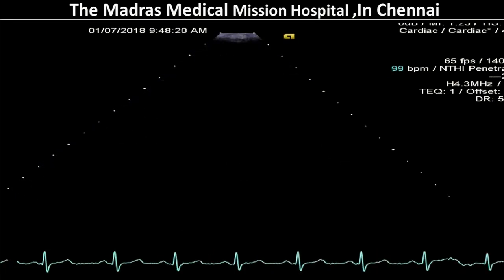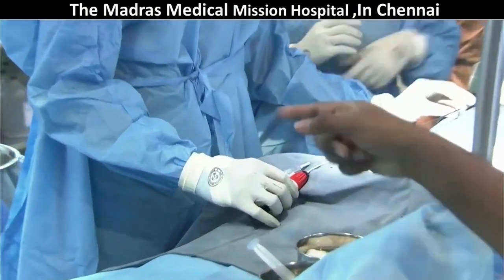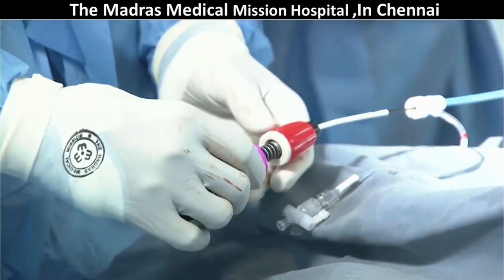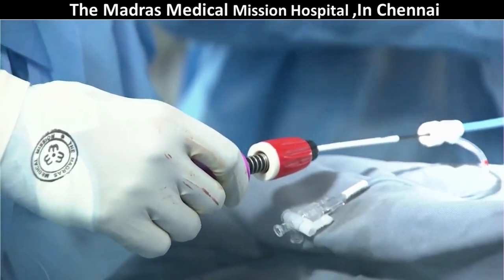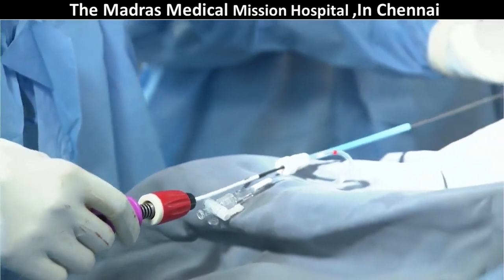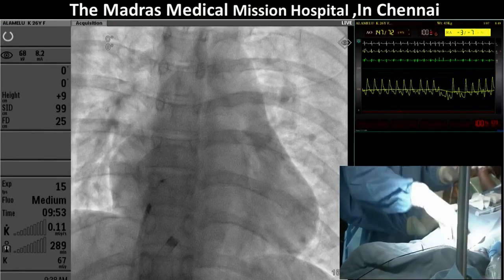IA down. Dr. Avinash will now demonstrate the release. Focus on the. So it has got a purple colored. Yeah, keep doing the fluoro. Purple colored, which he is now pushing it towards the. Now he has released the device. So the whole delivery cable has come out.